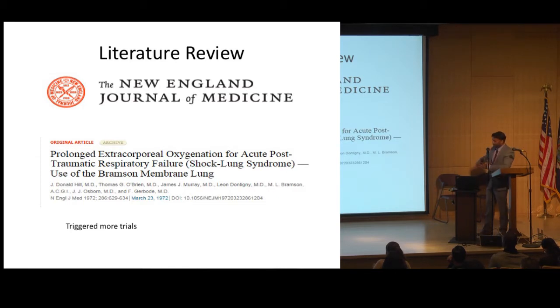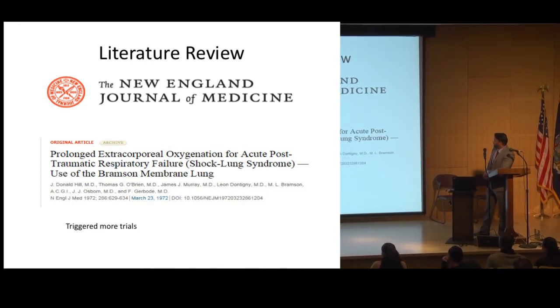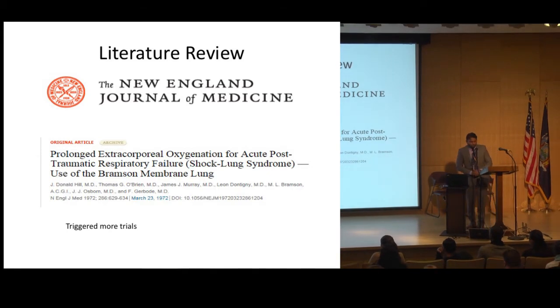So throughout the years, from the time that it went from a big machine to something like that, there was a lot of research that took place, right? A lot of research, a lot of experimentation in different parts of the world. So I put a few of the most relevant ones that we should know. If you look at the first literature that came out, what year is this? I see 1972. So we had another individual by the name of Donald Hill and Dr. Bramson. They had their own version of a bypass machine, and they performed an ECMO on a patient at that time termed as shock lung syndrome, which we now call ARDS, right?